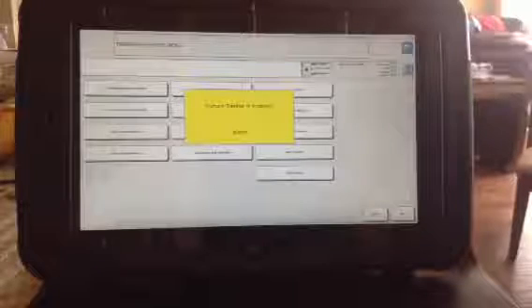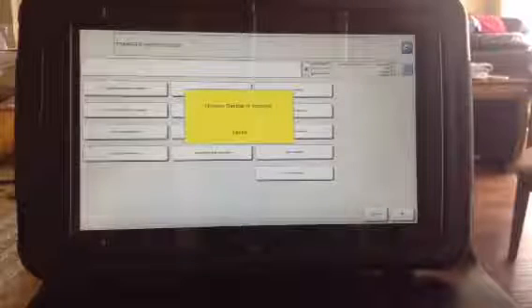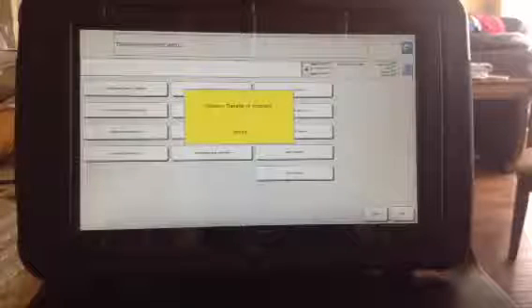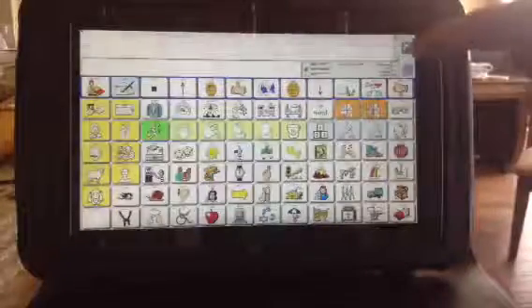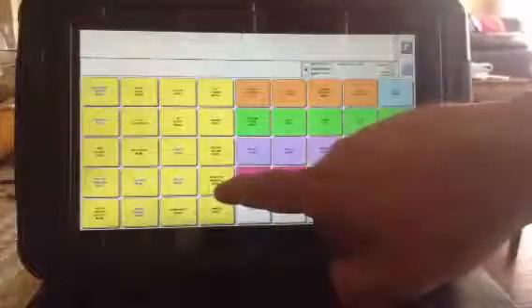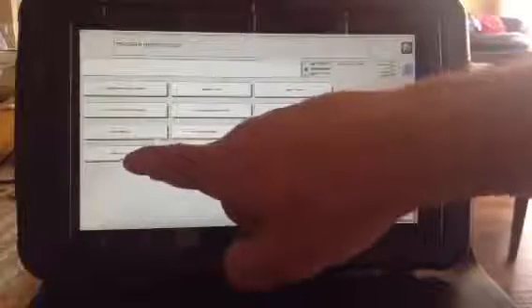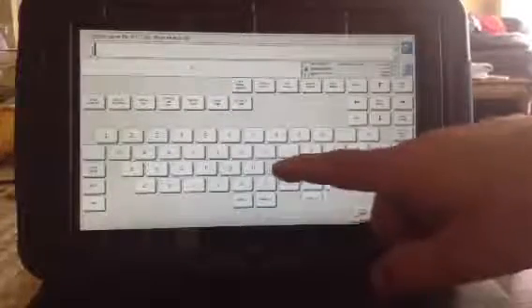Now it's backing up the entire device — that's all the settings in all six user areas, things like any remote control settings saved in there. It would have been less memory if I had instead gone to the tools, hit Transfer Memory Menu, and chosen Save One User Area. Then I could pick the area I usually use, say okay, and it knows that D drive is my jump drive. I can call it just JIK for something fast. See how much quicker that was because that was just one user area.